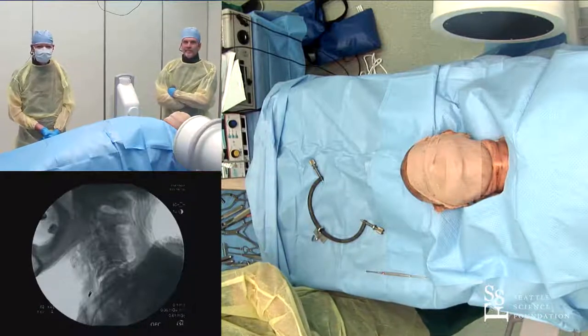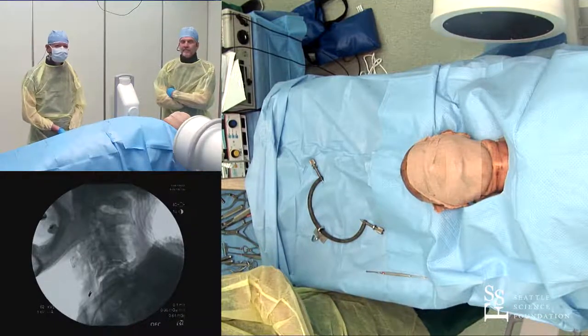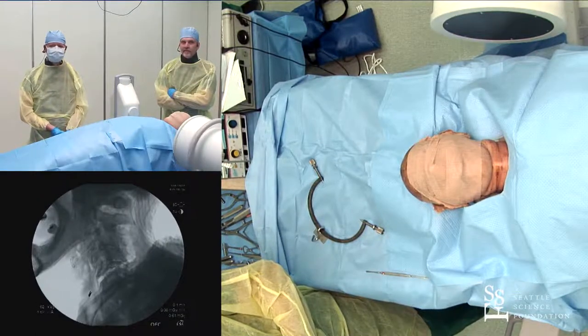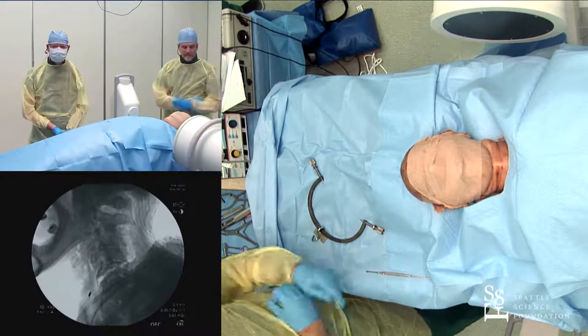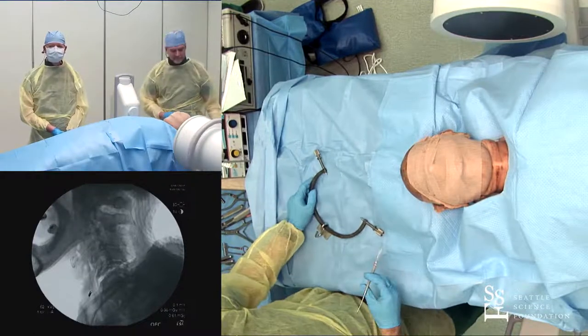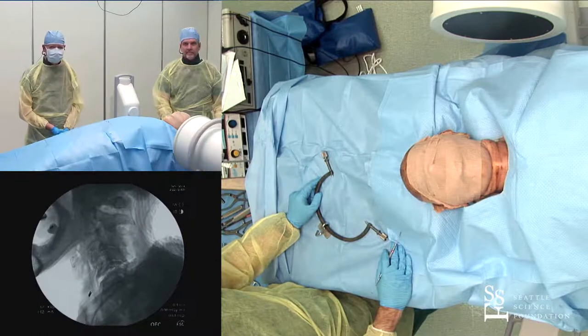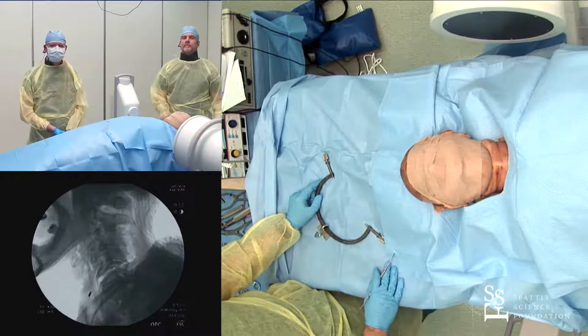We can see you guys sitting there. It looks like there's a C-arm shot and a cadaver. So we have a very nice view of this whole thing. Before you guys get started, I just want to ask a couple of questions to set the tone, because I think it matters.